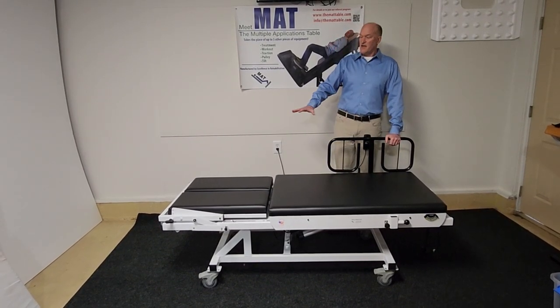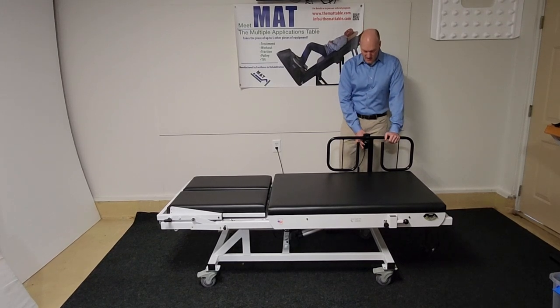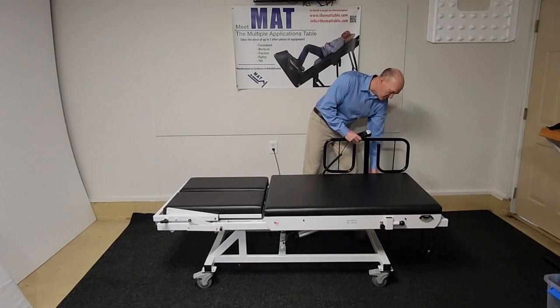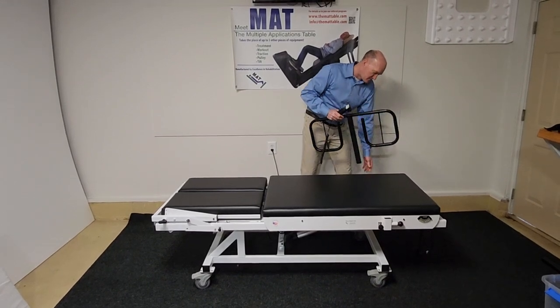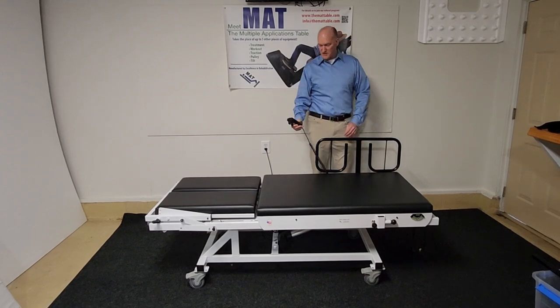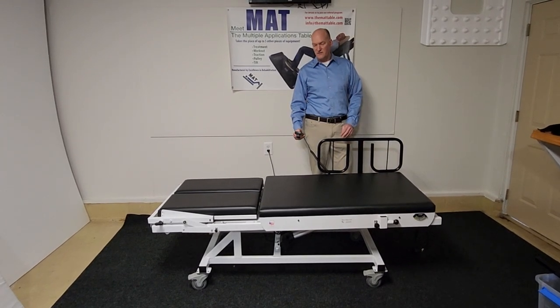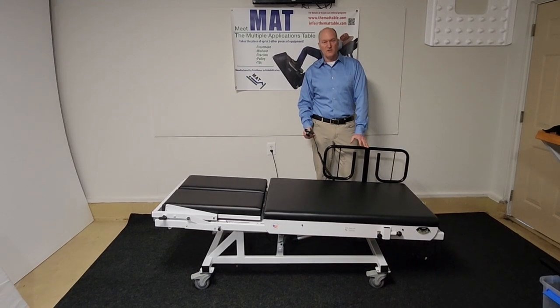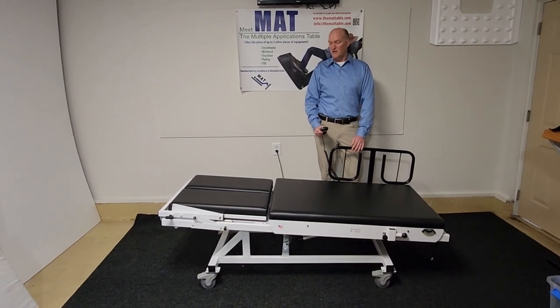As it is now, it is an exercise table and it has removable rails. The table tilts negative and positive, so you can practice bed mobility and facilitate bed mobility or resist bed mobility via gravity.